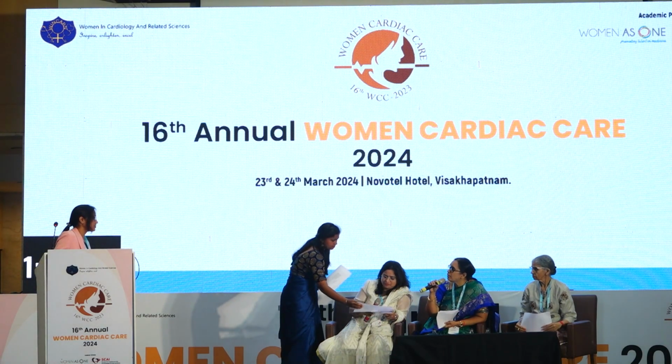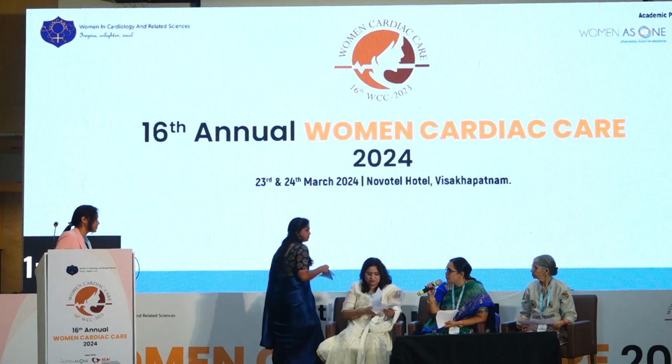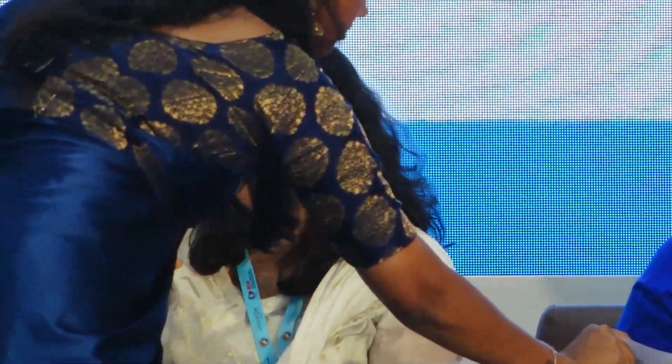See, this patient had ECG changes, ST depression in inferior leads, you told, is it not? But the RCA is normal, maybe because of the LM lesion. There were no other ECG changes, like ST elevation in aVR. Nothing is there. So that is another interesting finding. I did it in April 2023, and the patient is completely asymptomatic now. Okay. So, very good case, well handled. It is a little smaller size in the proximal part. You should have tried with a 3.5 or 4. It would have been better, but it's good. Well handled.